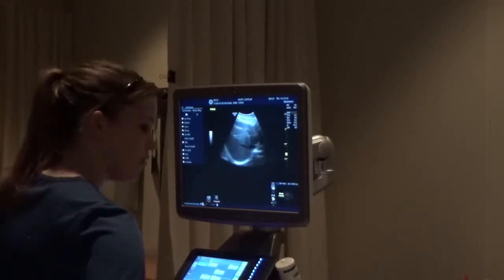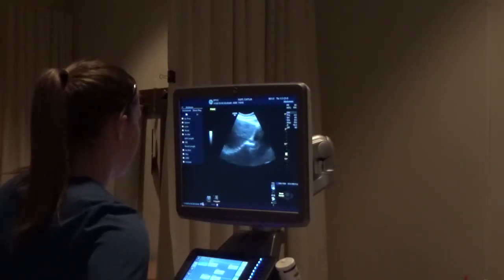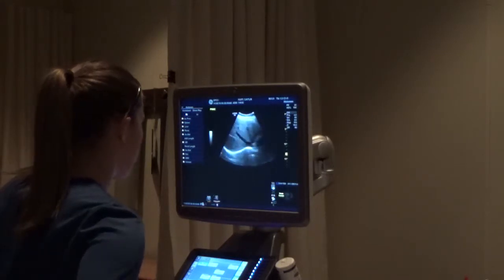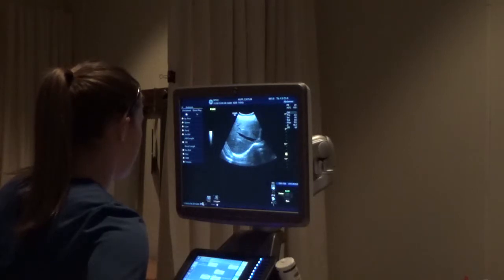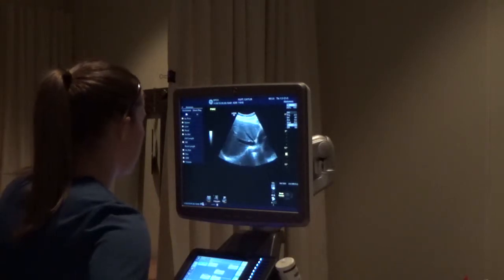Alright, take a big breath in for me. Hold it. Take one on the right. And breathe.